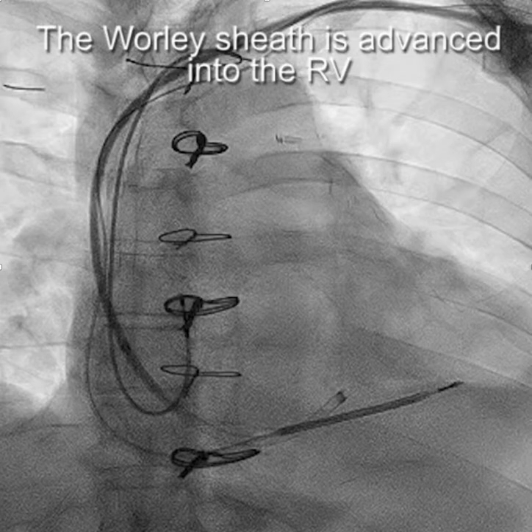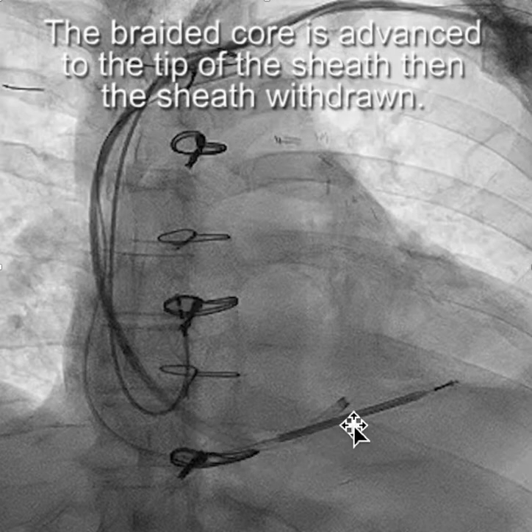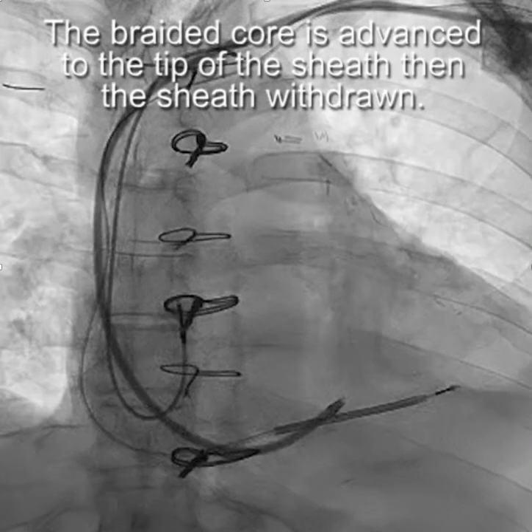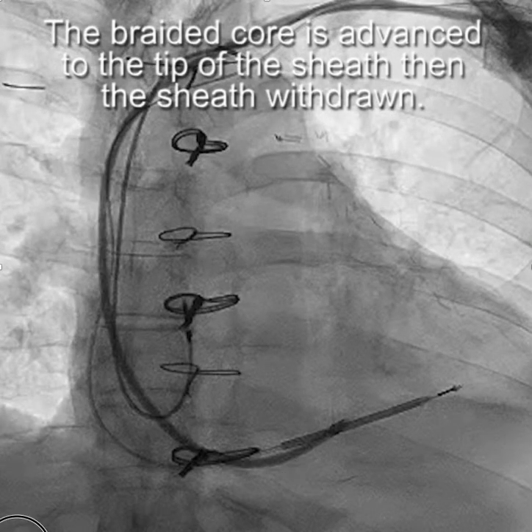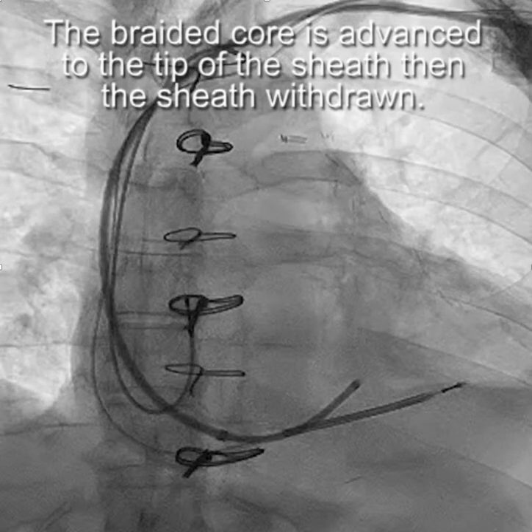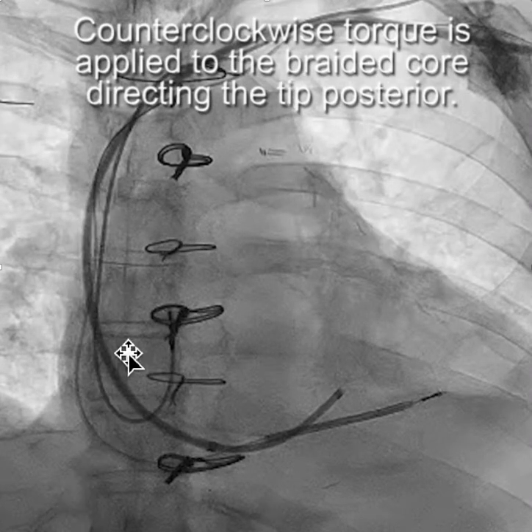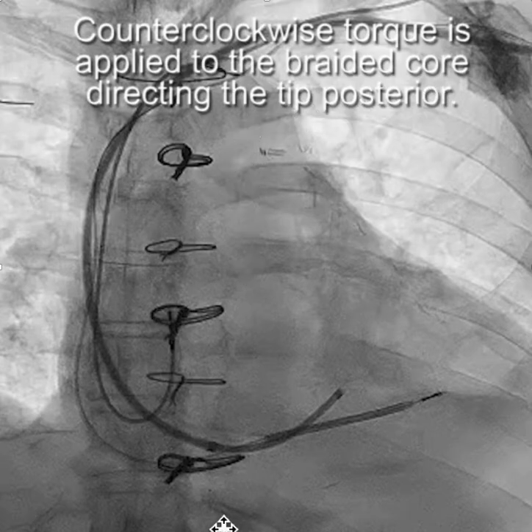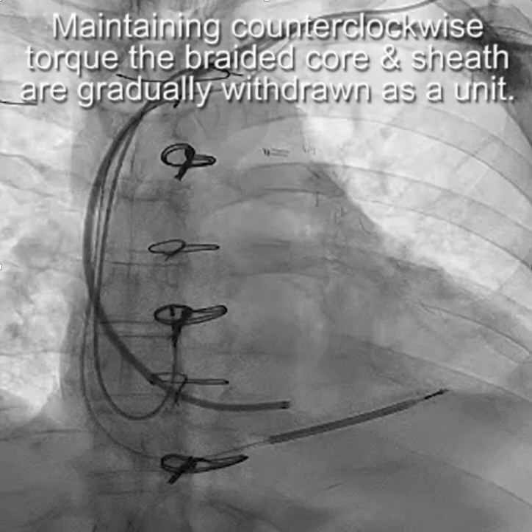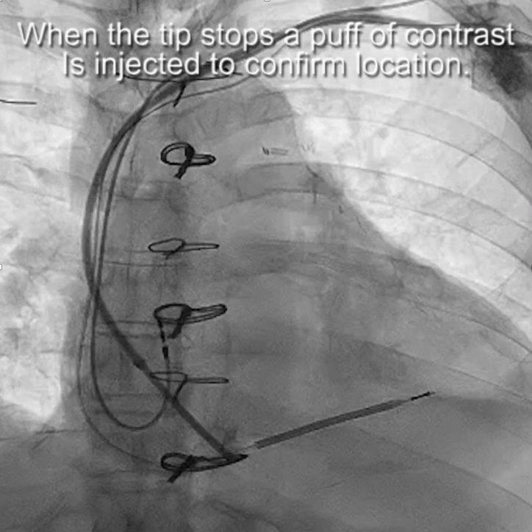So this is just an example. We have the sheath in the right ventricle, and we're going to advance the braided core until the tip of the braided core reaches the tip of the sheath. From here, we withdraw the sheath, exposing the braided core. Then we apply counterclockwise torque to the braided core, directing the tip posteriorly. Maintaining the counterclockwise torque, the braided core and sheath are gradually withdrawn as a unit, dropping the tip.